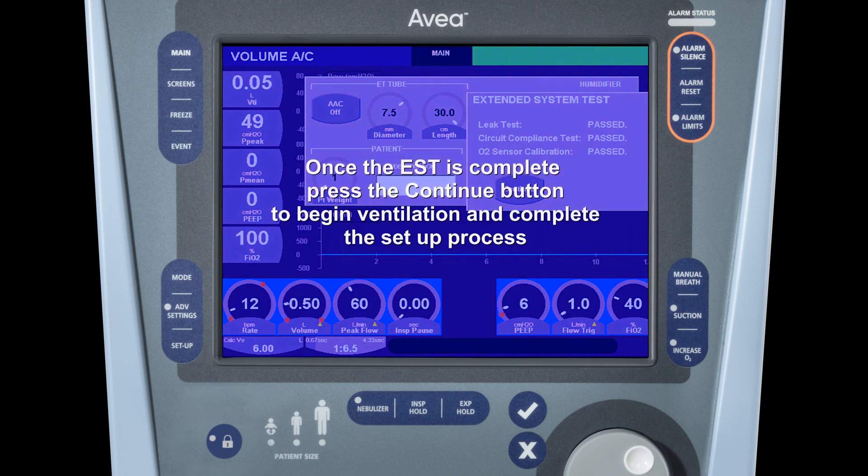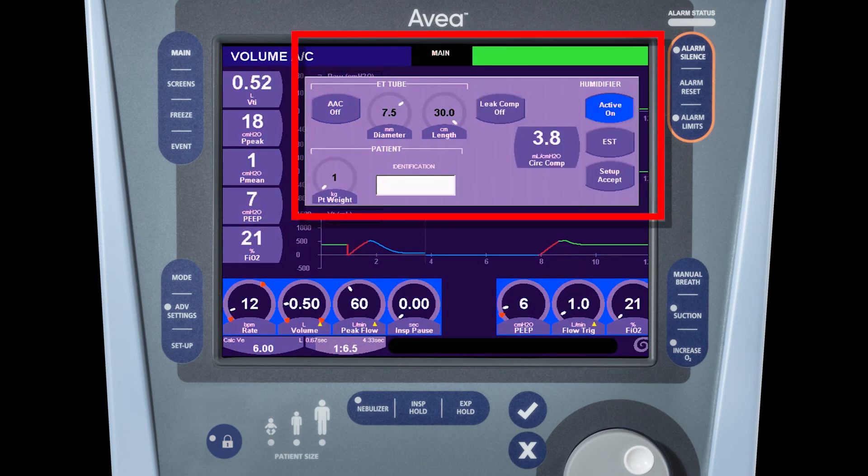To begin ventilation, press the continue button. You will now see the circuit compliance compensation value in the window, and pressing set accept will allow you to begin ventilating your patient.